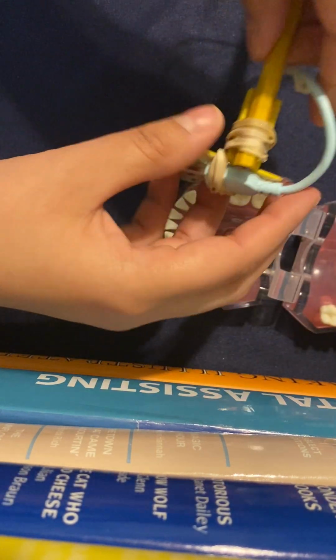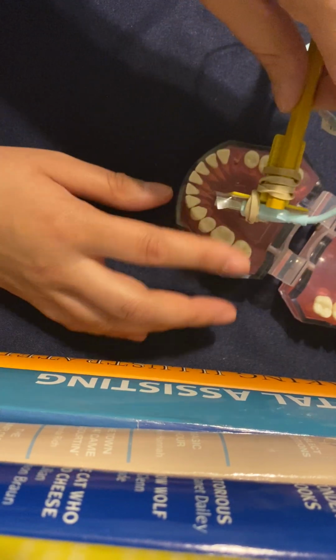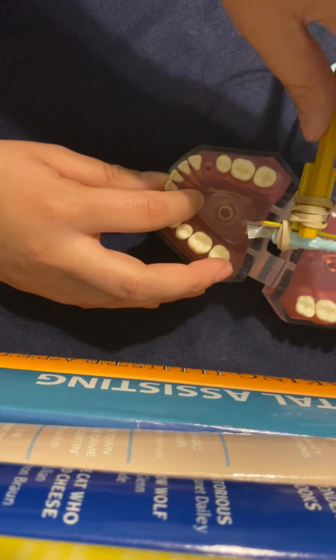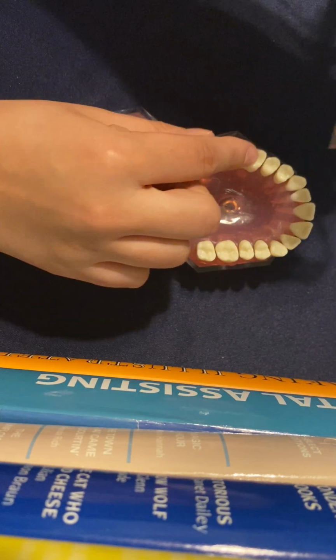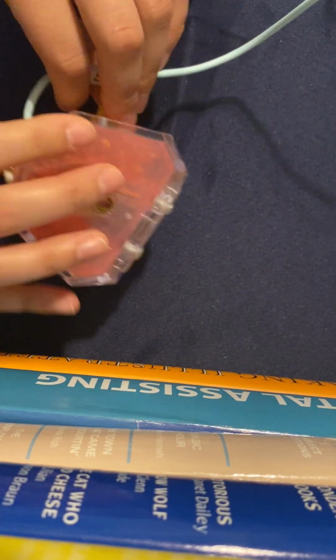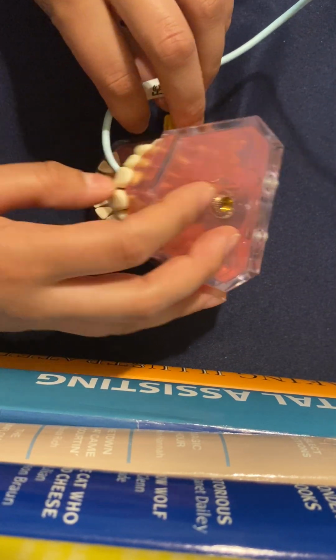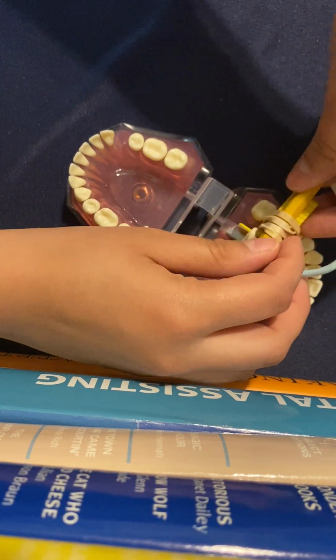Oh, wait, did I say the maxillary? Hold on. Yes, why am I doing it on the mandibular? Sorry about that. I was wondering why the cord was going in the back of his throat. So this one right here. Center.